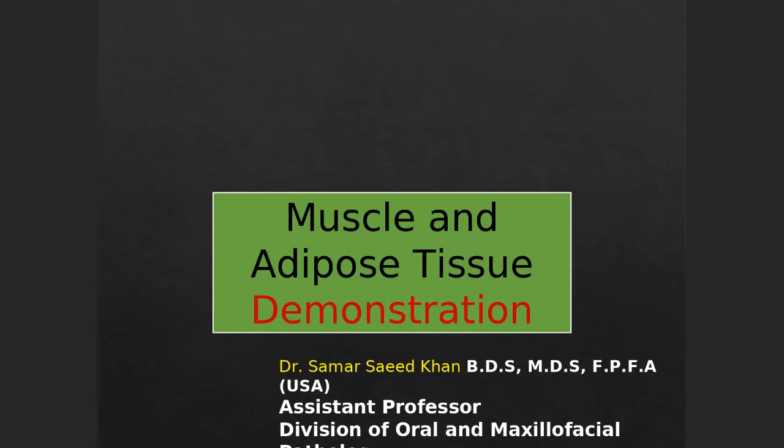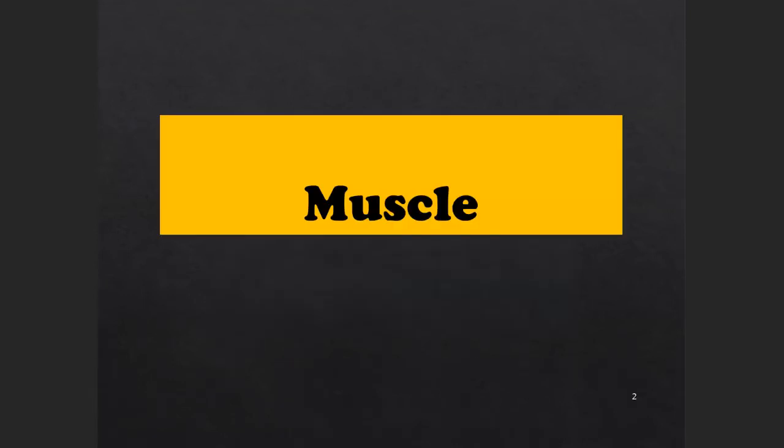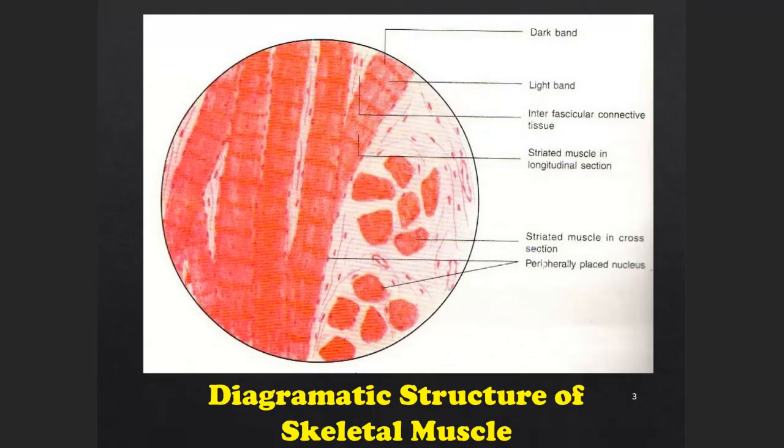Okay, welcome everyone. Now we'll start with the demonstrations, okay? Now first we'll start with the muscle. Now see, this is the diagrammatic structure of the skeletal muscle.